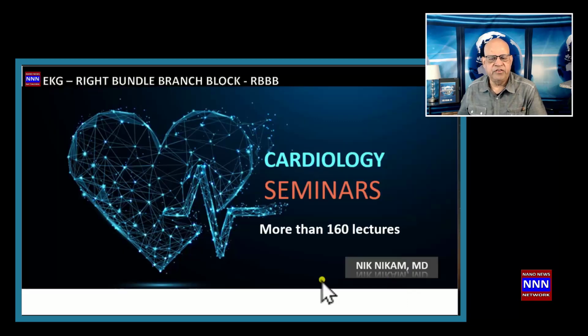This is Cardiology Seminars. The focus today is going to be right bundle branch block EKG findings and clinical significance.